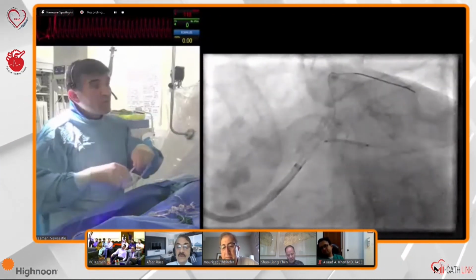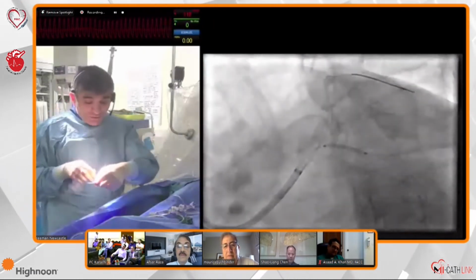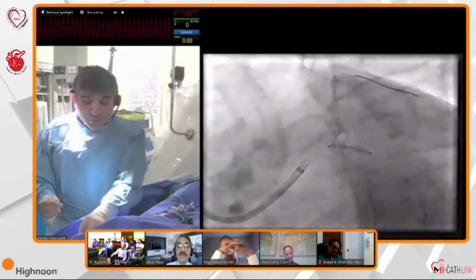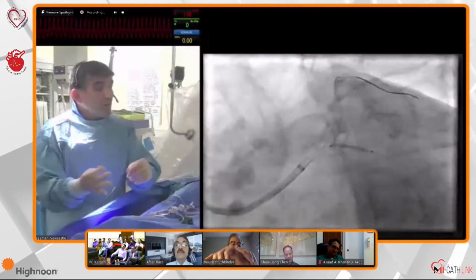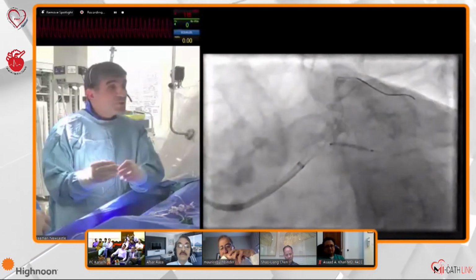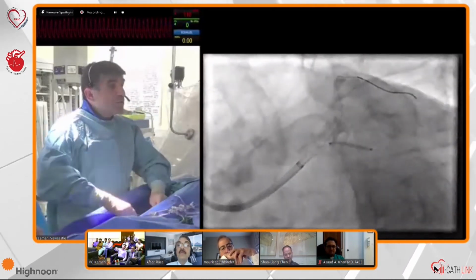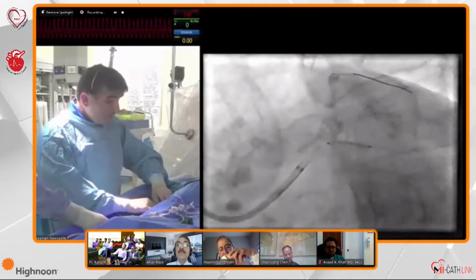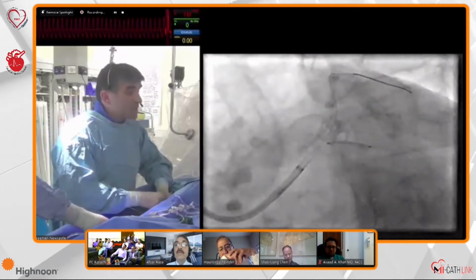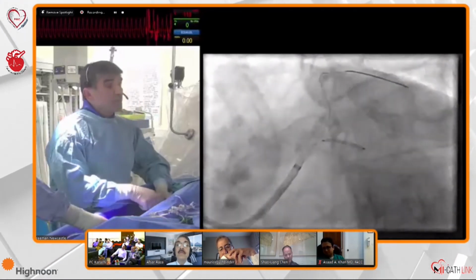Once you put your stent in the main vessel, if you're happy with your side branch, it is a landmark where you could drop your ostial side branch stent. As you can see in this view, and if I'm not seeing it, I could go to 30 frame or to stent boost. And that tells me that they are kissing. It's not protruding to the left main. It's not away from the ostium, just perfectly on.